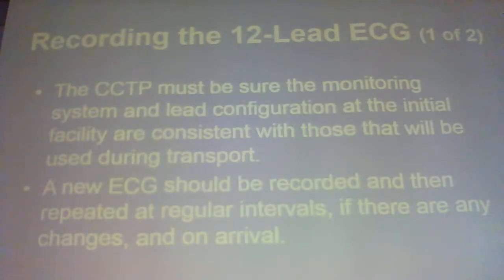All right. Just like a set of vital signs, you need at least 2 12 leads. Your initial 12 lead, and then right when you're pulling in to the ER, another good opportunity. I would tell you that you probably should do it every time there's a significant change.